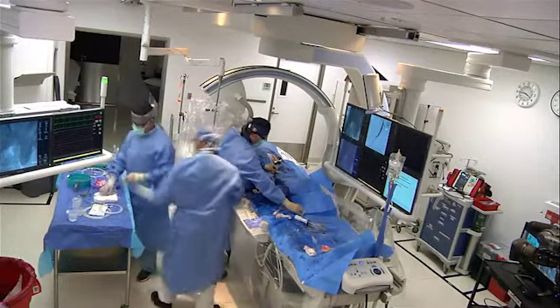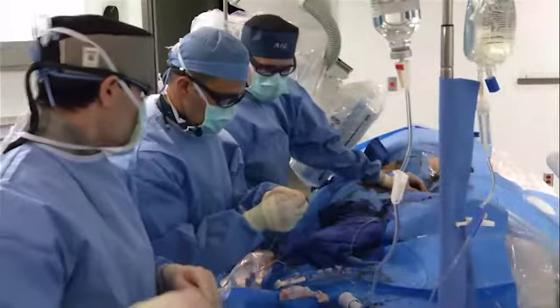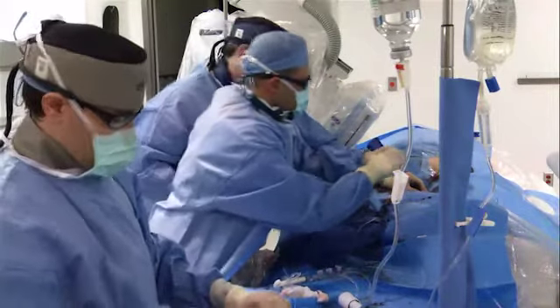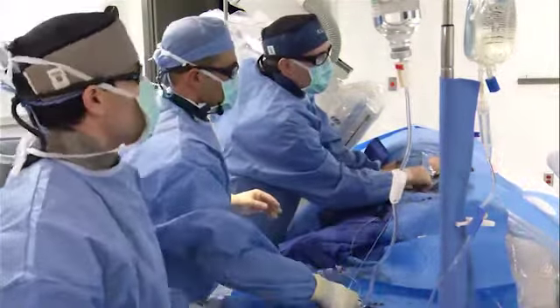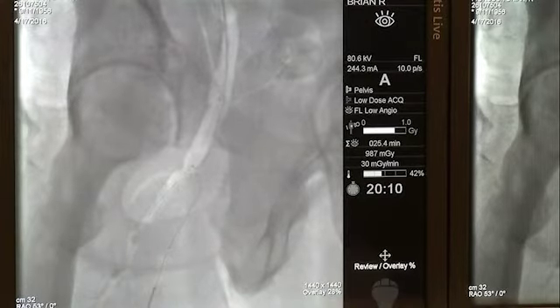Okay. Come a little bit faster, Brian. So let us try this in two views. So these are some of the, go ahead. So we're going to come with the GR4 here and see if we can point it. Remember, he has had the common femoral endarterectomy and patch in the past and prior bypasses. So some of his anatomy is all changed.